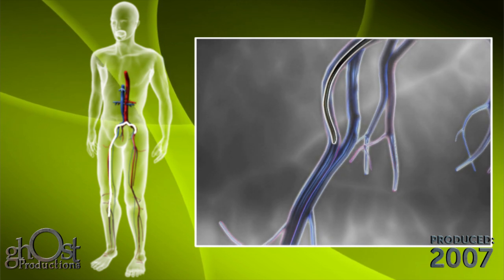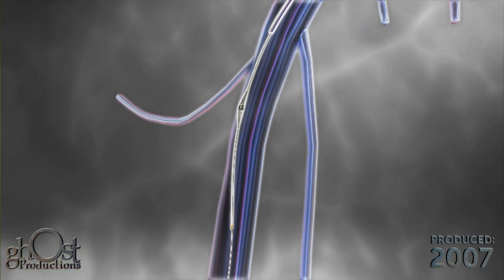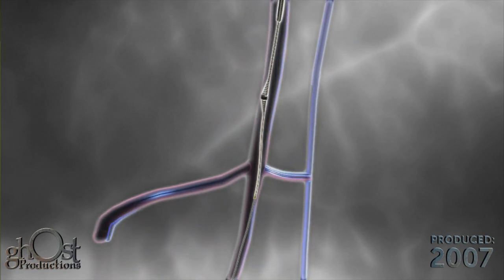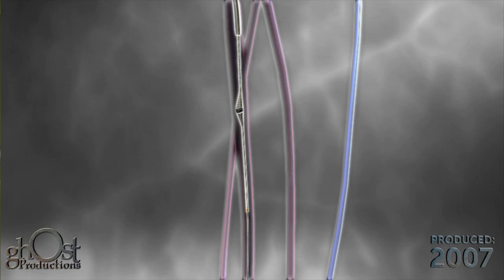A viper wire is advanced through the introducer sheath and past the lesion. The viper wire is the platform around which the Diamondback 360 orbits during the procedure. The flexible shaft is back loaded onto the viper wire and tracks around vascular bends to the treatment location.